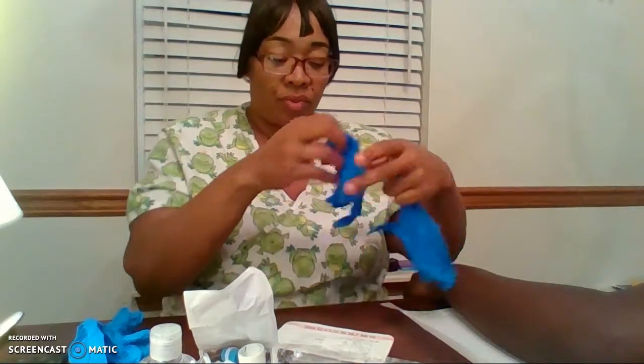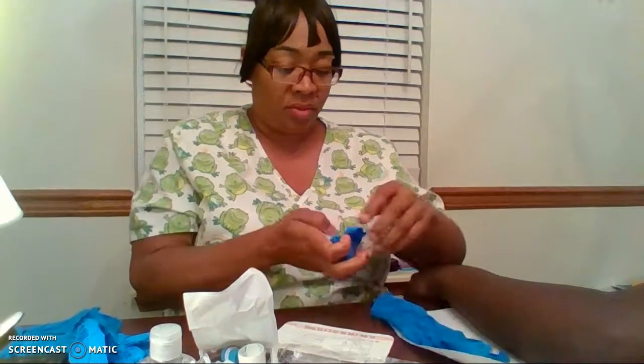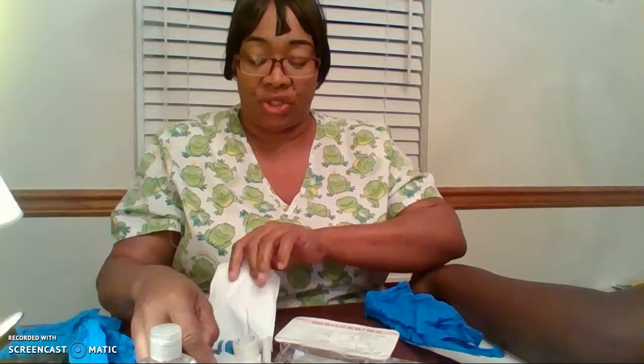So you're going to perform hand hygiene, of course. In my unit, we use the foam outside of the patient's room to foam in as we're going in. I'm going to don gloves. That is to protect yourself and also to protect the patient.